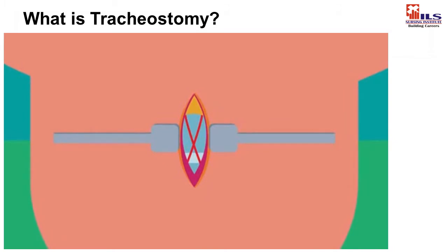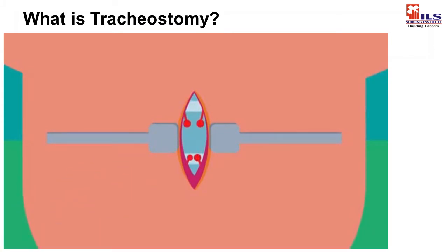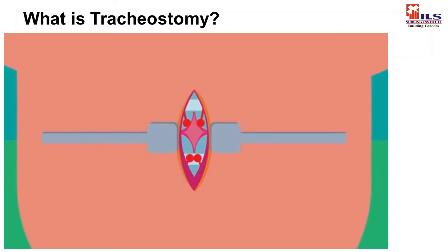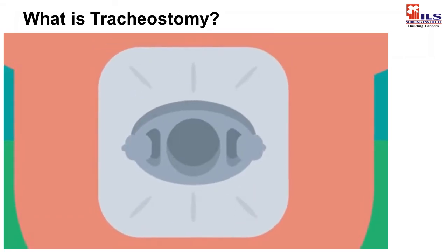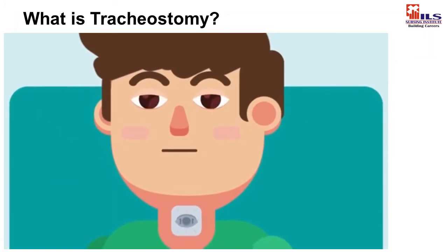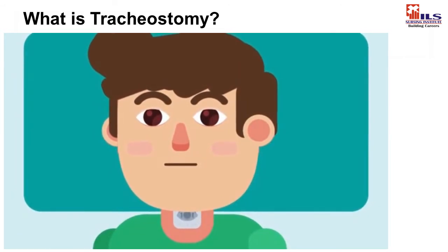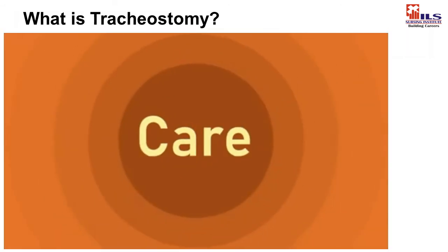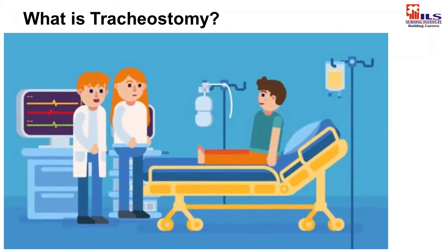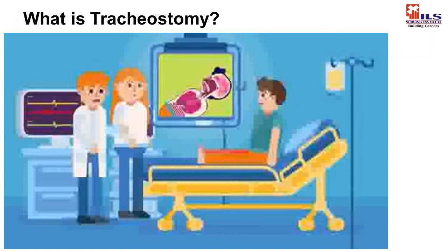If thyroid gland is encountered, then it is displaced upwards, or may be cut. Any blood vessels encountered along the way are ligated. Incision is given on the trachea. A hole is made and the tracheostomy tube is inserted, preferably through the second or third tracheal ring. The skin incision is closed and the tracheostomy tube is secured to the skin via stitches or simply tied around the neck.